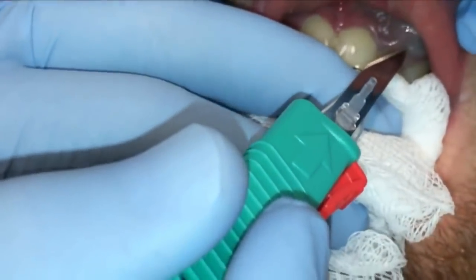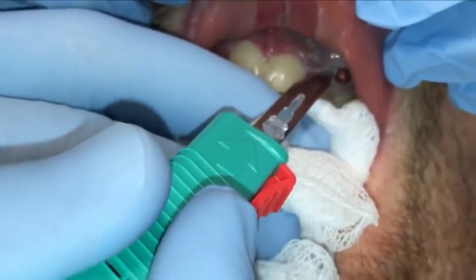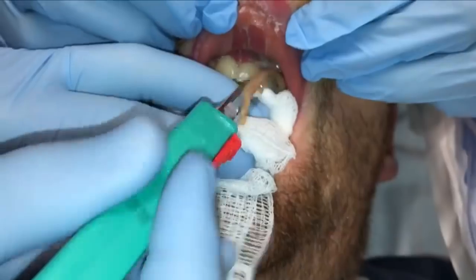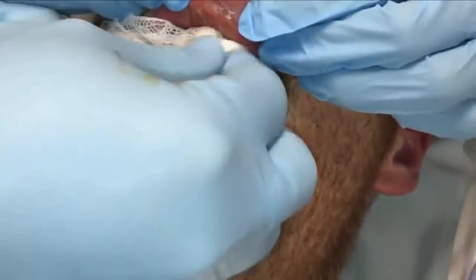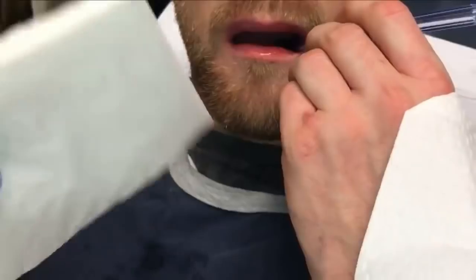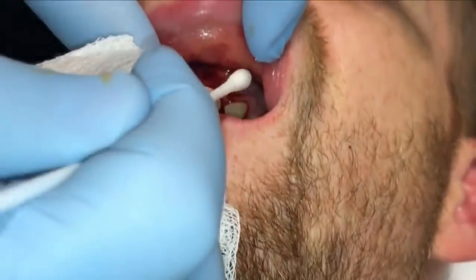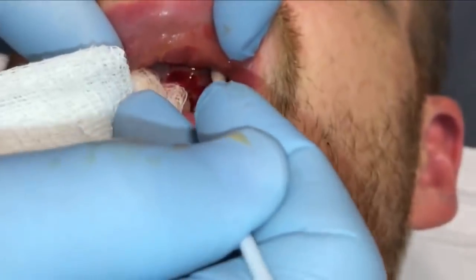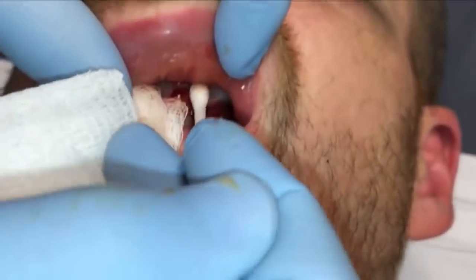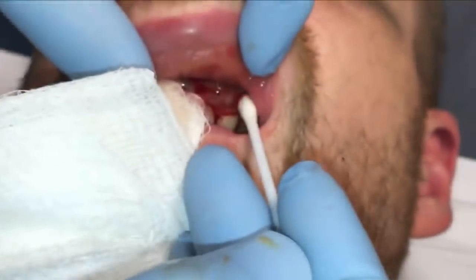After the patient irrigated his mouth, washed out and everything, we looked at it again — it was definitely deflated. We used a cotton swab to kind of milk it, and no more pus came out. At that point the patient was discharged, but we did upgrade his pain medication. He was taking hydrocodone, so we gave him oxycodone to give him some better relief.